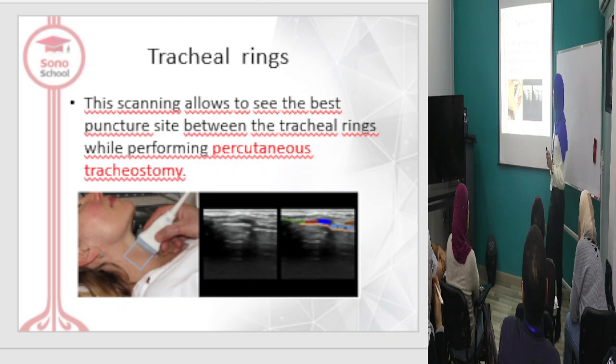Trachea rings. At the end, I will revise again. Okay. Trachea rings, as I said, beads, and this is in surgery for percutaneous tracheostomy.